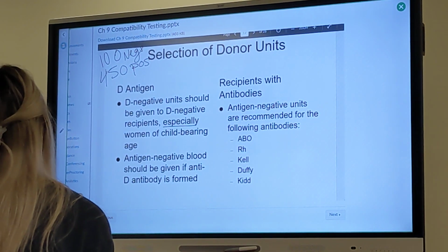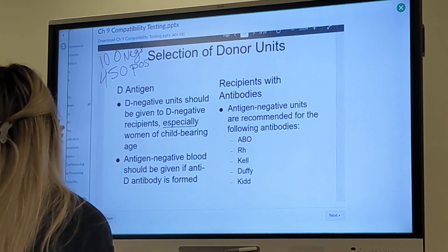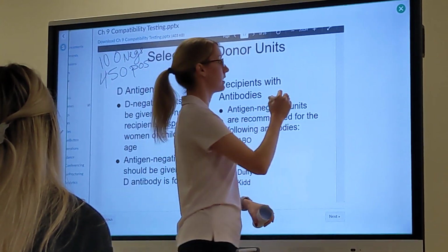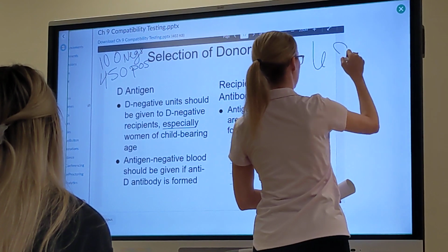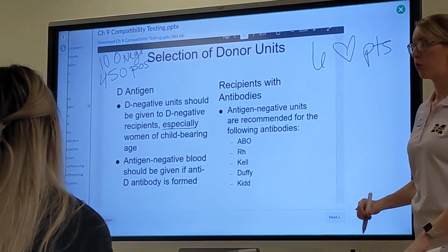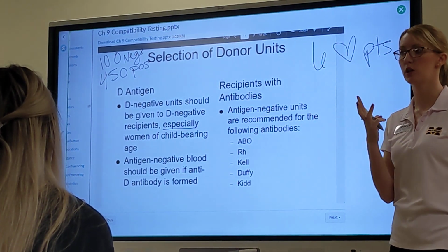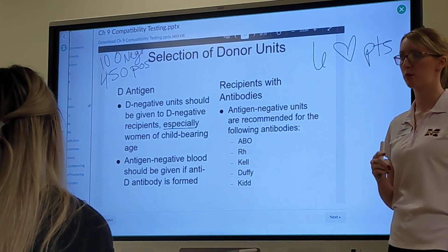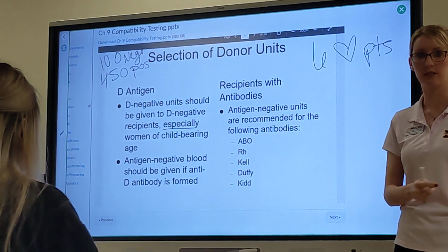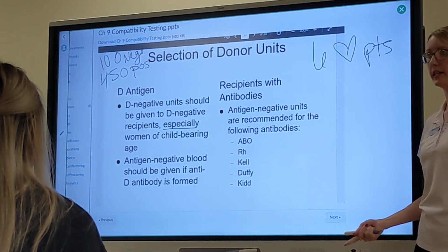Okay. So say somebody's in heart surgery, they're O negative. They used to order 6 units on heart patients, you don't have to know any of this. If somebody is considered a heavy user, which means they use more than 3 units in a 24-hour period, and that was just our policy. Make sure you are familiar with your policies. They're going to make you sit down and read them all. You're not going to remember all that. You go back and read it when you need it.